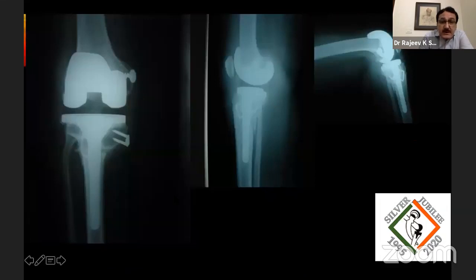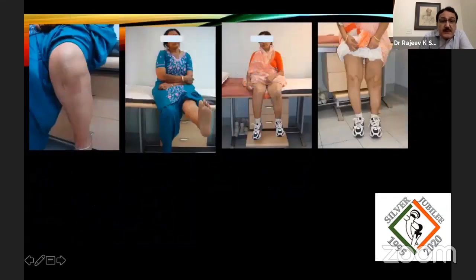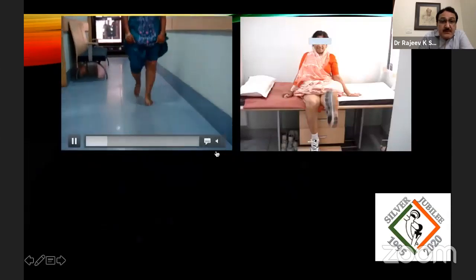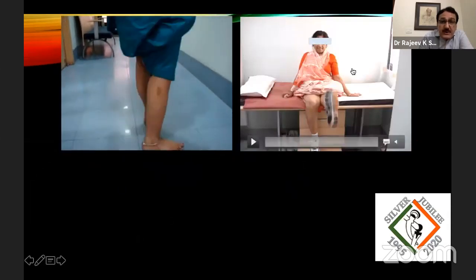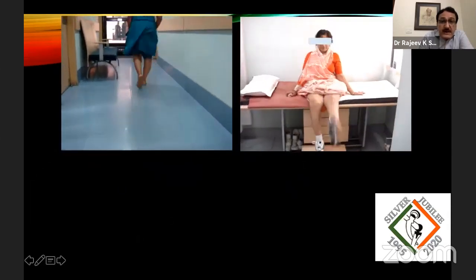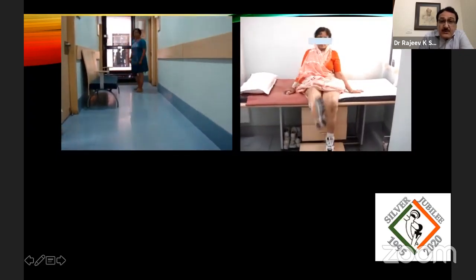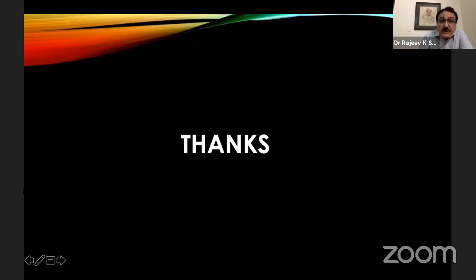That's the patient's X-rays. This patient is around 7 or 8 years post-surgery. We can see that walking and balancing is good. The function in flexion extension is very good. This patient was able to follow almost very easily. The gait was excellent. Thank you so much.